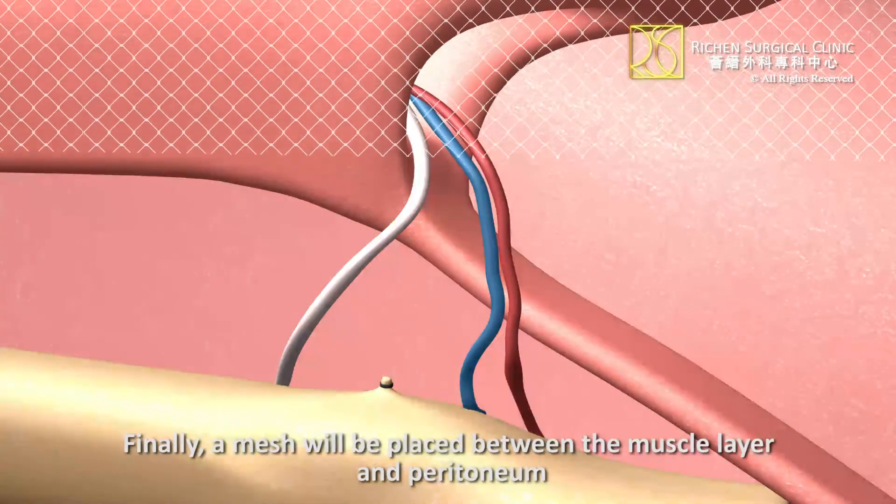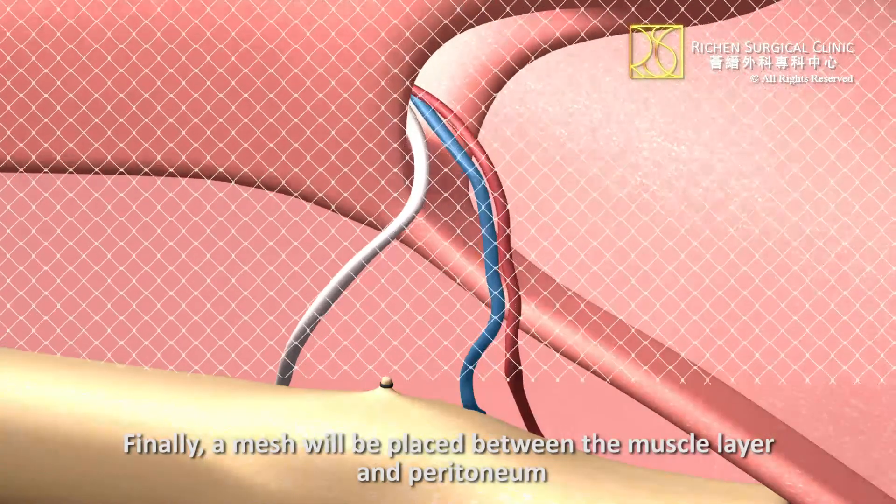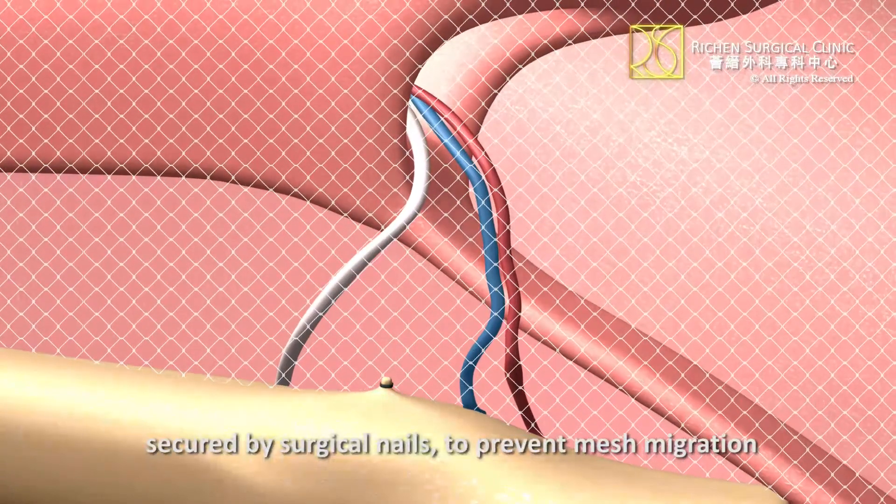Finally, a mesh will be placed between the muscle layer and peritoneum, secured by surgical nails to prevent mesh migration.